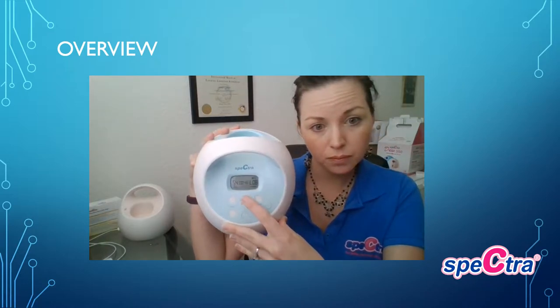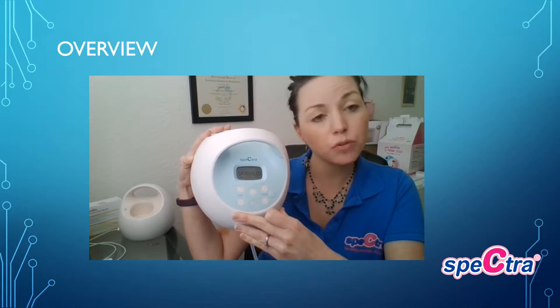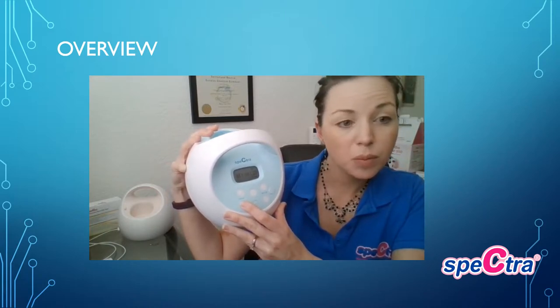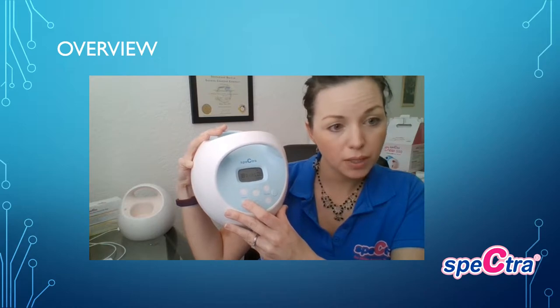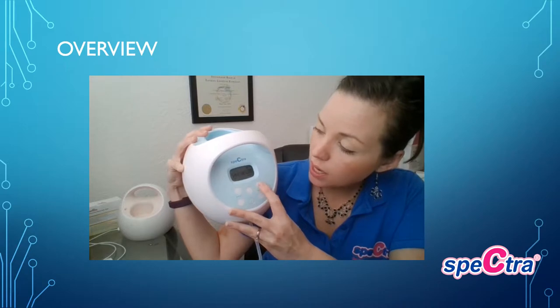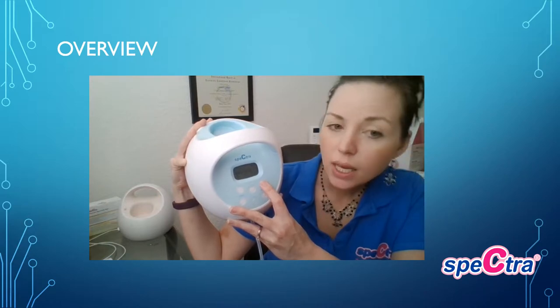When your milk does start to let down, press the wave button again and that puts you into expression mode. A healthy full-term baby is going to be between 46 and 54 cycles per minute, which is why the pump is normally set at 54. You can go all the way down to 38 — that range of 38 to 42 is more for younger gestational or NICU babies. Listen to your body and work with the customization; you can change the cycle from 38 to 54 and the vacuum goes from one all the way to 12.